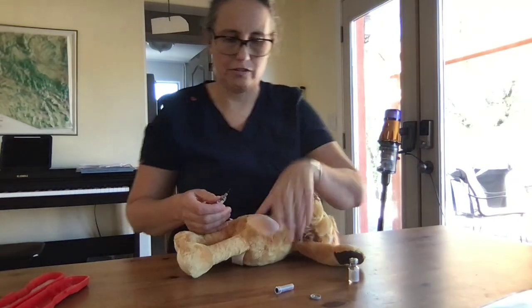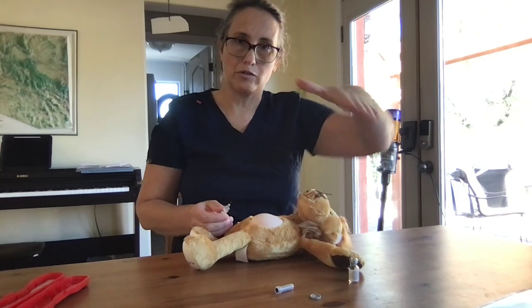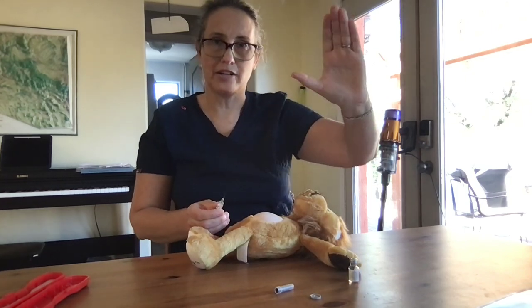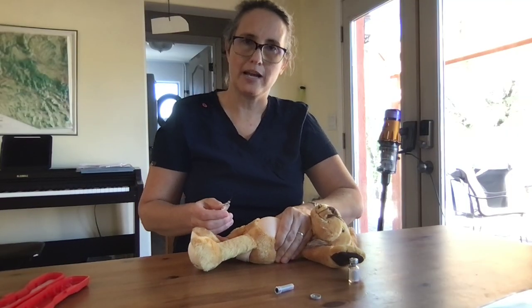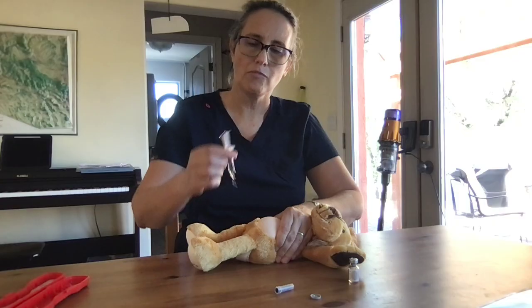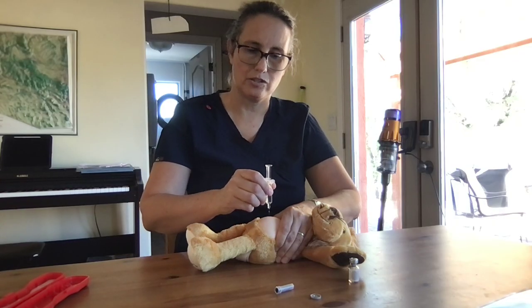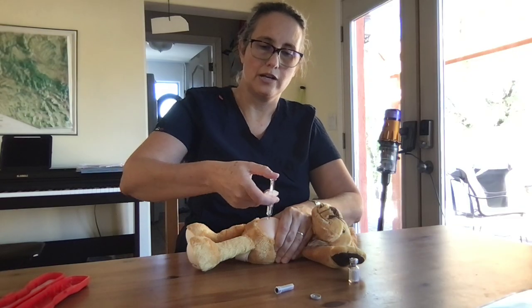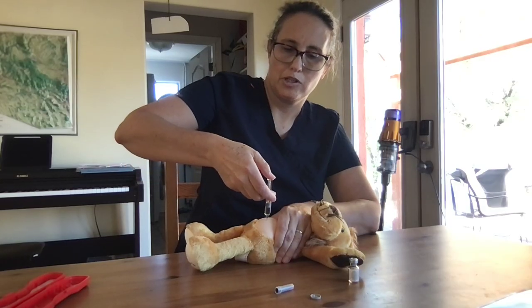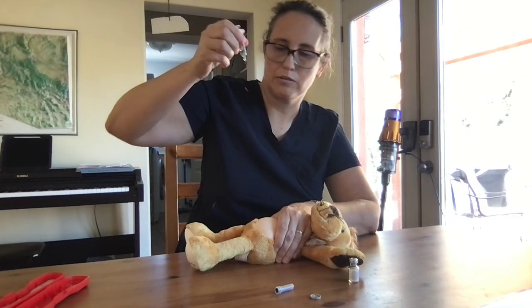First thing I'm going to do, and you can do this through clothing, is make a V with your non-dominant hand and give a nice press up. Grab a nice big section of that leg muscle. Going straight down at a 90-degree angle, you're going to go well in the middle of that V so that you're not injecting yourself. Go all the way down. You're then going to move your thumb up to push down on the plunger, injecting that whole solution into the leg, and draw straight up.